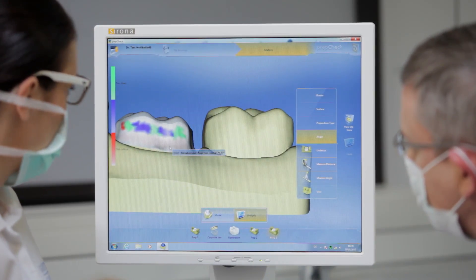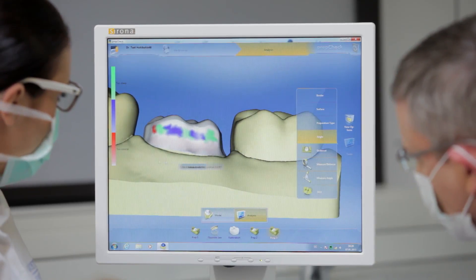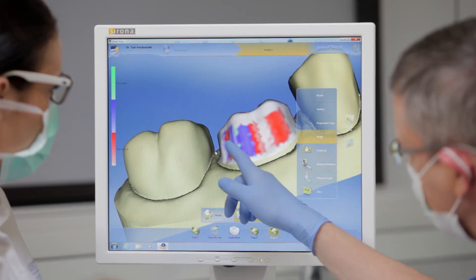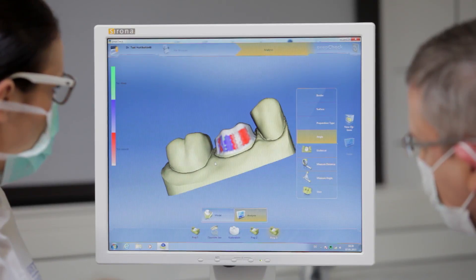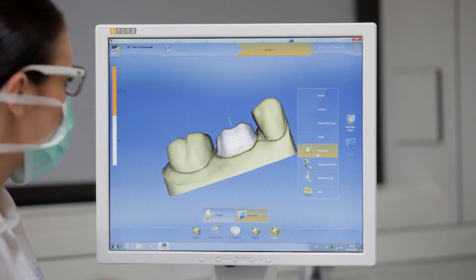The blue areas show that the preparation lies within the tolerance range. Green means that more must be removed, while the red areas show that too much has already been removed. All this makes the assessment particularly objective and serves to provide direct quality feedback, establishing whether and to what extent such preparations lie in the clinically acceptable range.